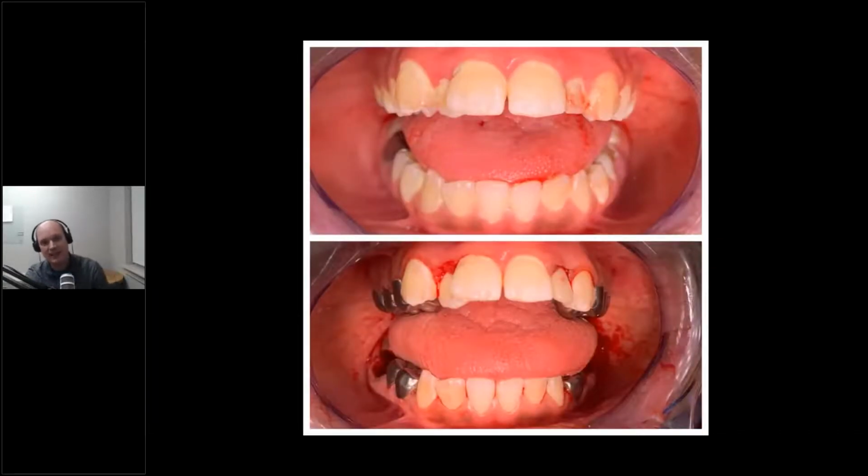Here you can see a high caries risk individual, anterior decay on number 8, restored with Riva Light Cure HV, and then a composite strip crown, full coverage, where we had endo done on tooth number 10. Very, very good outcome in this high caries risk kid and individual. So that's going to last long.